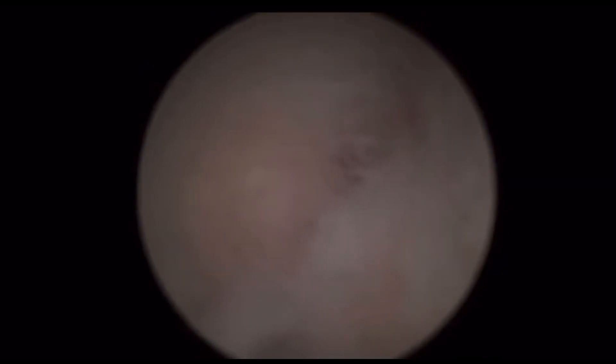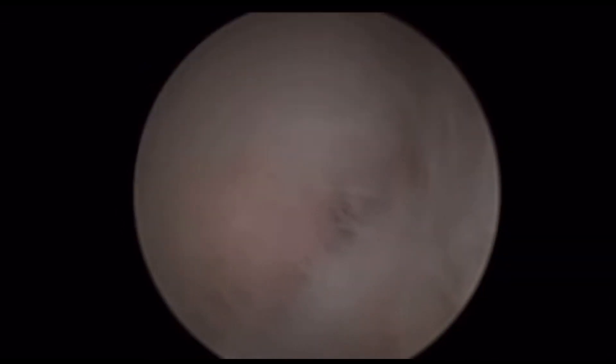You can obviously see that a space is created, but it is all lined by white-colored tissue. This white tissue is, in fact, a weak atrophic endometrium — same as green grass deprived of water that turns brown. So look here: there is a landmark, there is a clue.